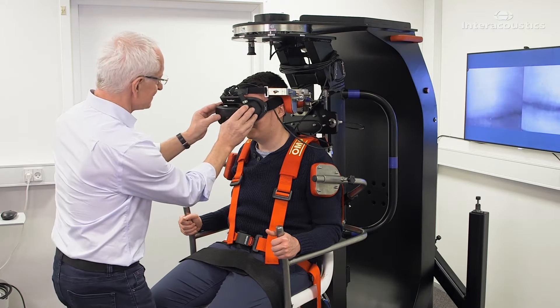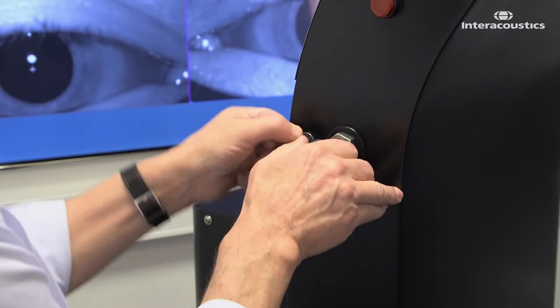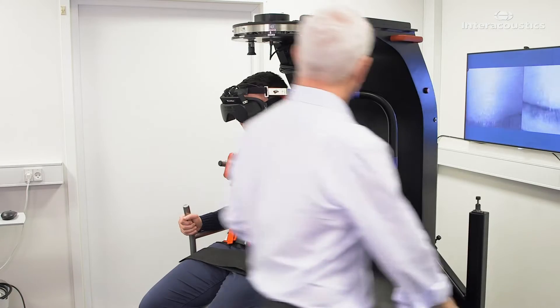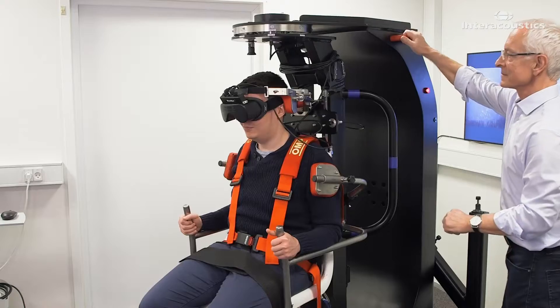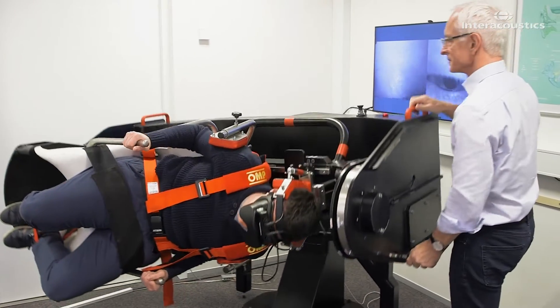This is how you treat a unilateral multi-canal BPPV in one treatment. First, lock the augmented stop arm in a 45-degree upward position, where it will collide with the upper shock absorber. Unlock the main arm of the chair, and bring the patient into the horizontal position with the affected ear to the floor.